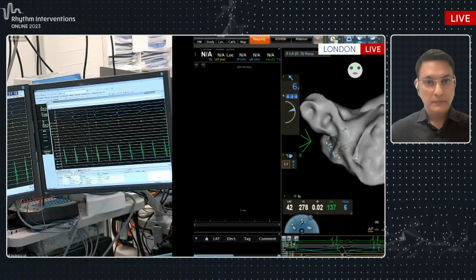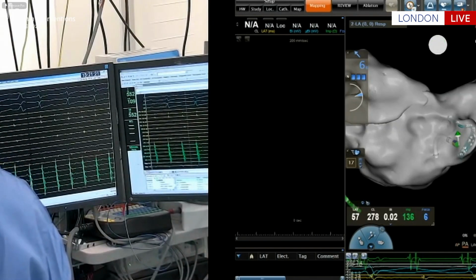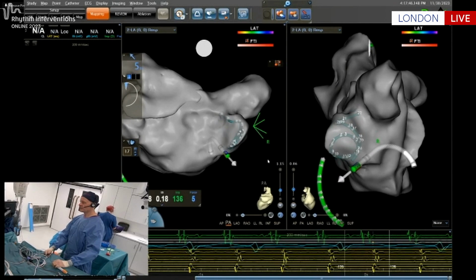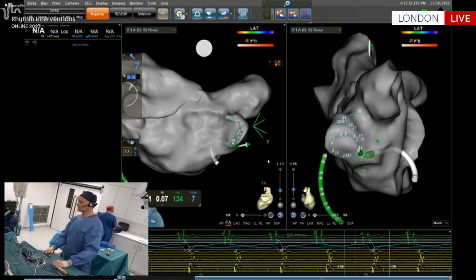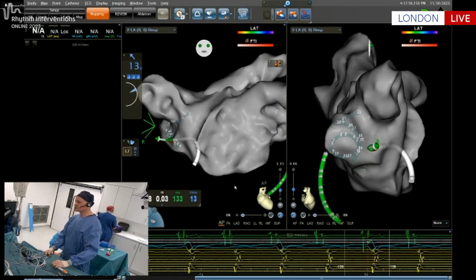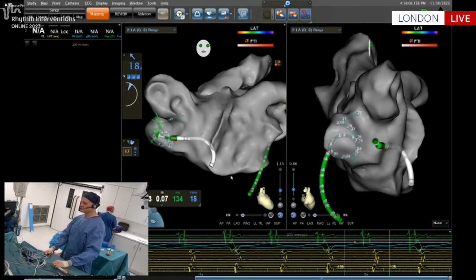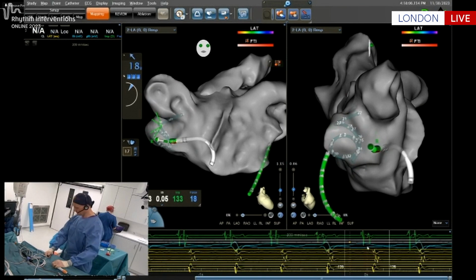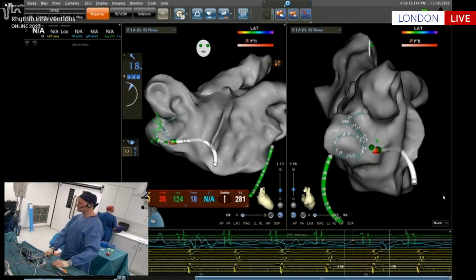But I just wanted to briefly show you the vein. Can you show me a PA view? So I've just swept the catheter around the veins very briefly, and you can see there's not really much signal on the posterior wall, inferior wall with the mapping catheter, not much. And then AP, please, on the left. Rotate the left view around to the right very slightly. There's just a really low amplitude, long signal you can barely see on the map. So I'm just going to go there and see if that trims off that PV, and then I'll answer your question, Diraj.